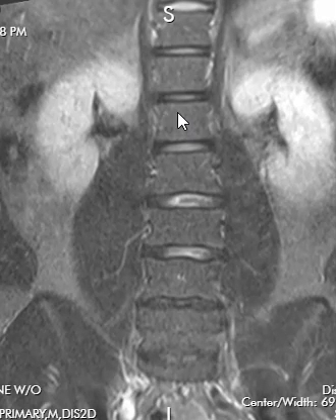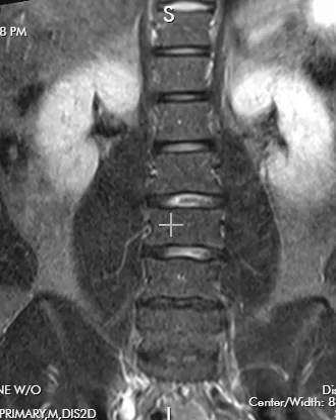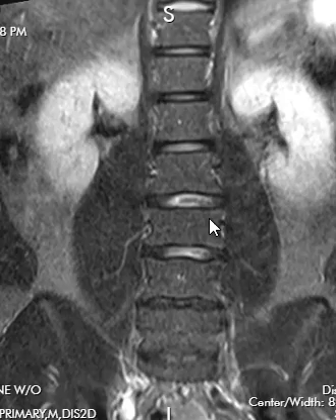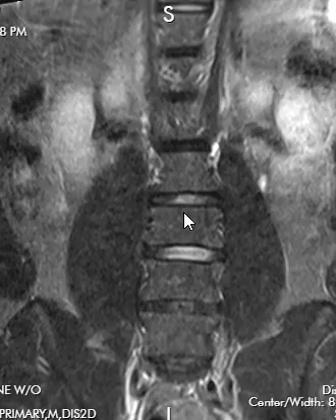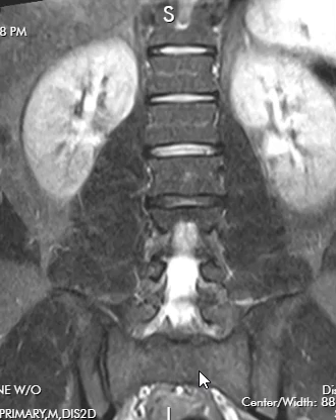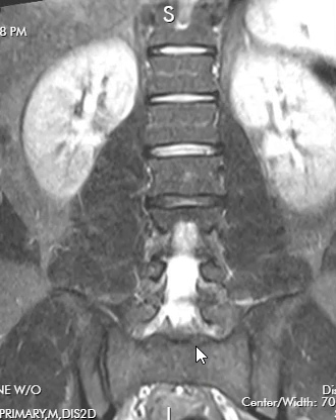Also on this view you can see the curvature. If patients have scoliosis, the spine will twist towards the left or to the right. This patient has almost a perfectly straight curvature — maybe some minimal levoconvex or leftward convex scoliosis, but it's so minimal it's not worth mentioning. We also look down low; sometimes you can see into the pelvis to make sure there's not a pelvic mass, cyst, or any other abnormality.